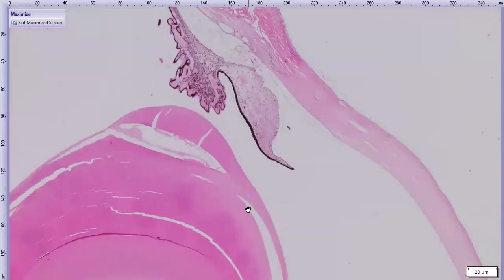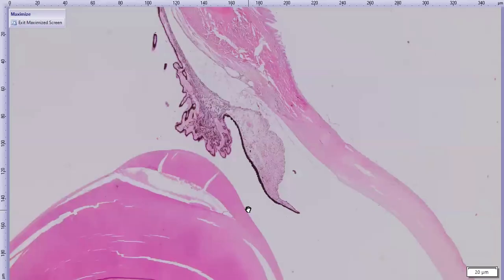I'm going to switch back to the pelican now. When I showed you the gross picture of the hawk eye, I pointed out this structure at the equator of the lens, which I call the annular pad of the lens. And so birds have this structure, the annular pad, right where the pars plicata attaches to the lens. So there's a difference in the way the lens epithelium is formed.